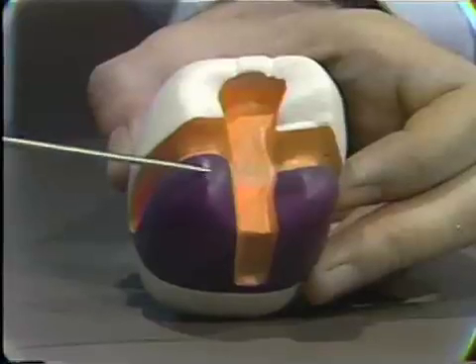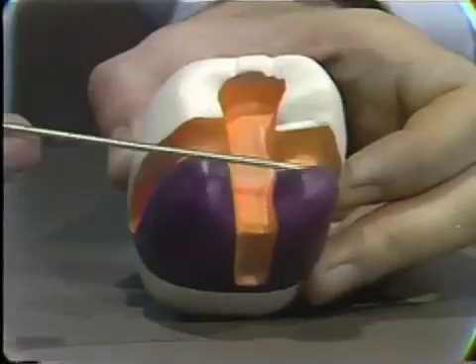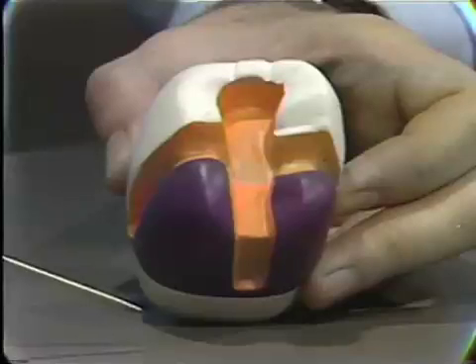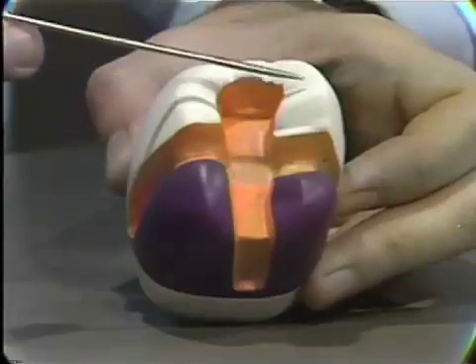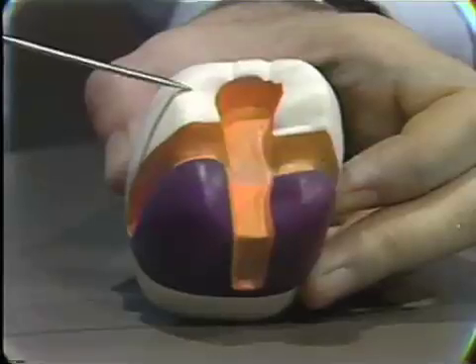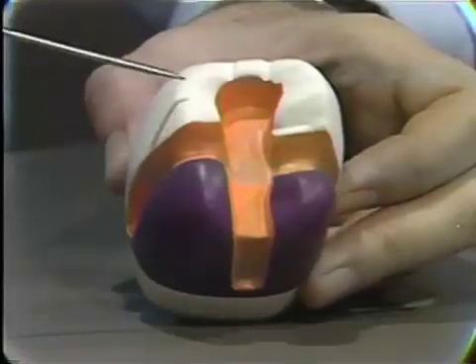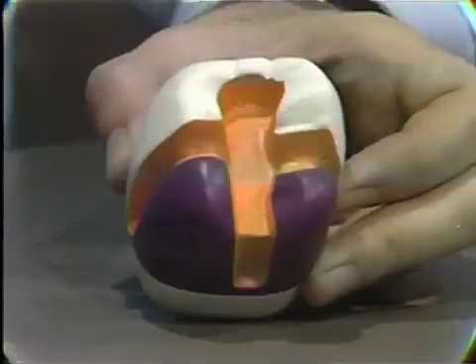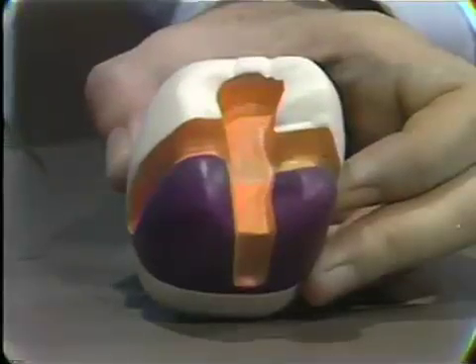And you can see that the mesial cusps on the buccal and the lingual are covered and protected by the restoration. However, in this particular preparation, the distal cusps on the lingual and the buccal are not protected. They can be if the situation requires it. The preparation can be extended to give protection over those distal cusps also.